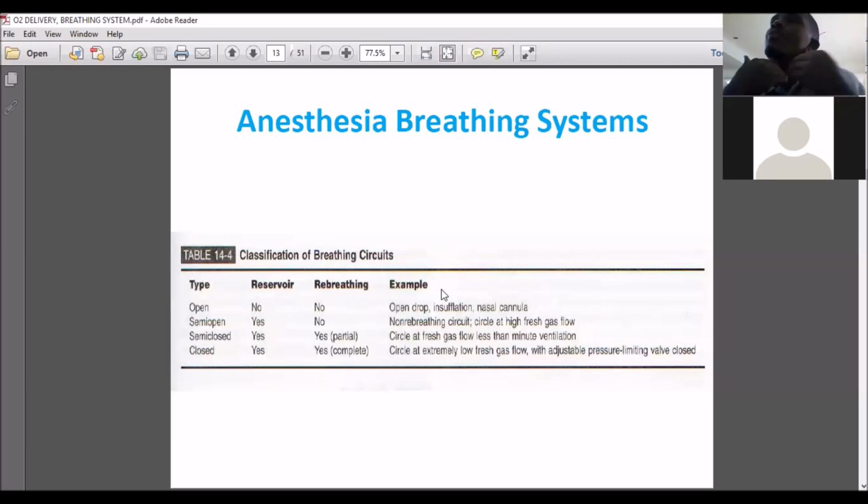You're on a machine. I've put for you an endotracheal tube, okay? What came out of your system, not the carbon dioxide, in that oxygen I recycled it back. I added oxygen for you. Then when I added oxygen for you, you breathe it out.